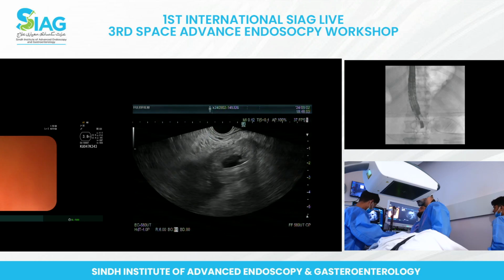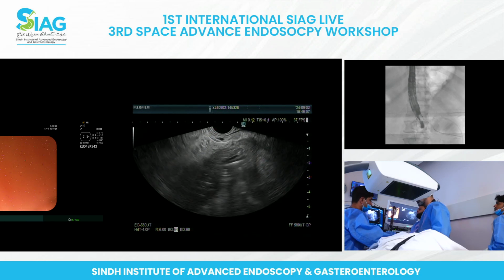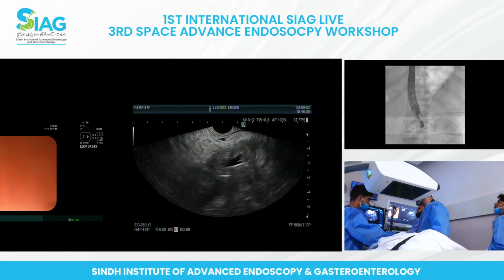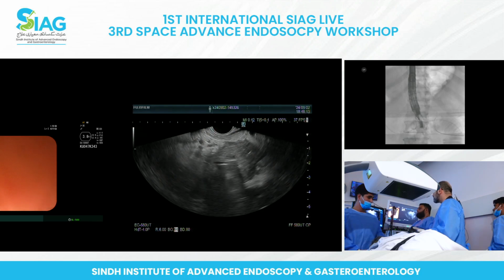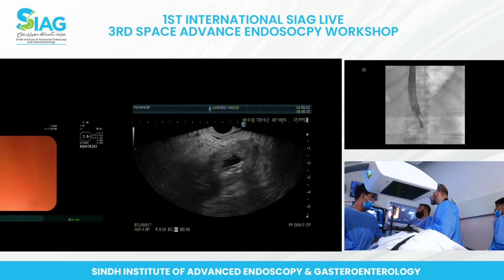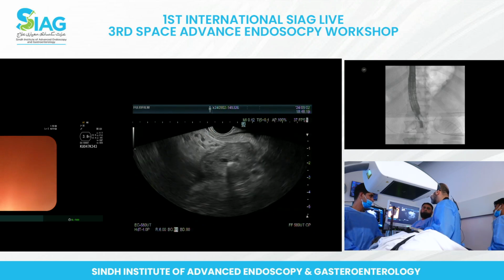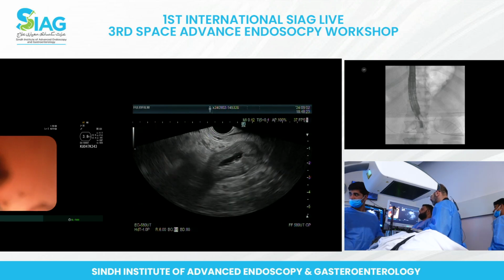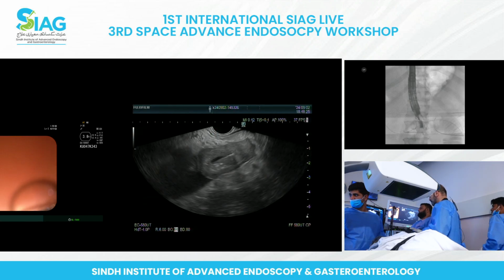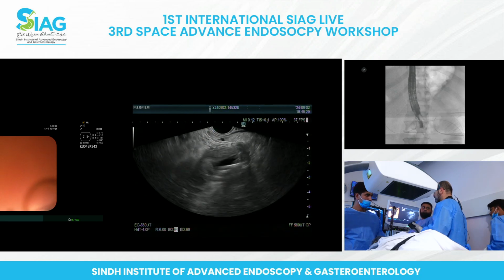Fluoro is live. I'm just gently putting the balloon back. So this is where the nasobiliary drains are much better, because you get so much faster filling than the balloon. So what I wanted to understand was, when you've got the balloon inflated, you're actually filling the segment distal to the balloon, correct? That's what we're trying to do.